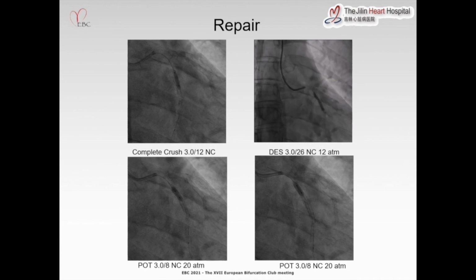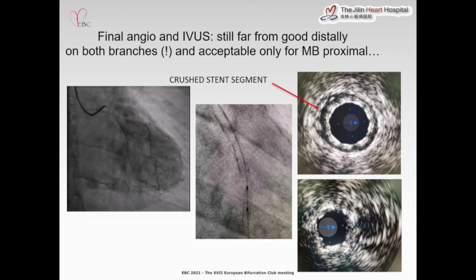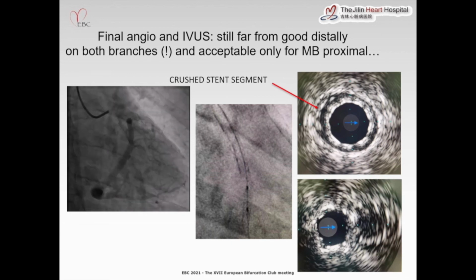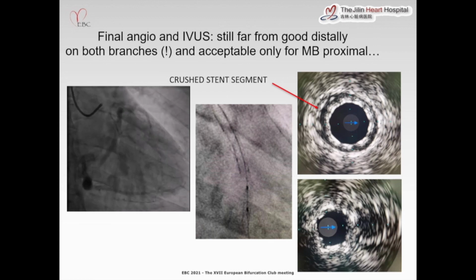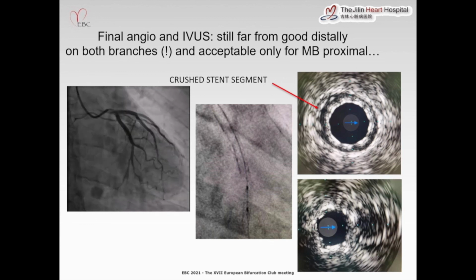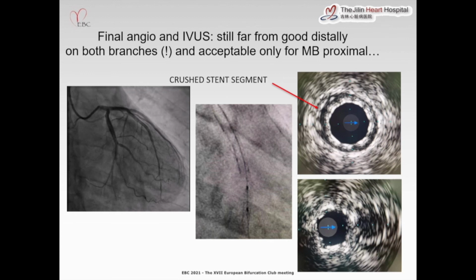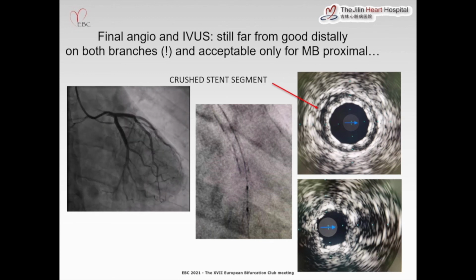But this was not completely successful in repairing what happened at the bifurcation and at the origin of the two side branches. You see the result, also with another stent boost, is ugly, terrible.